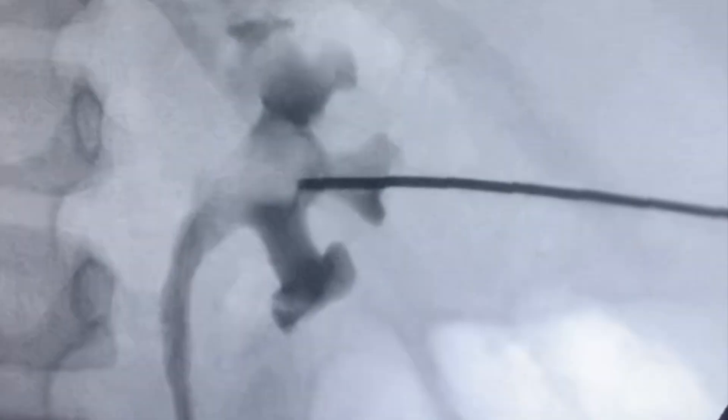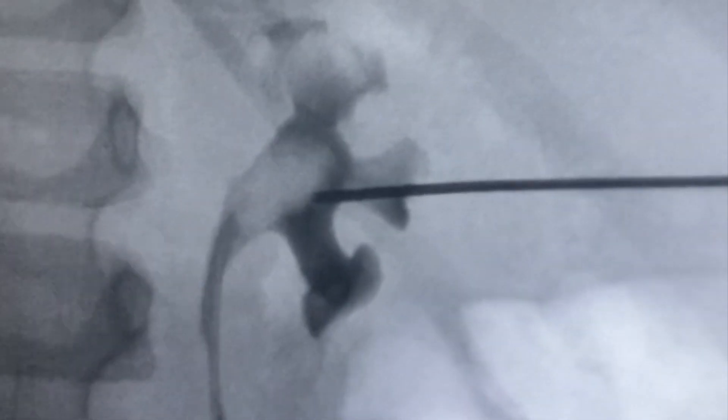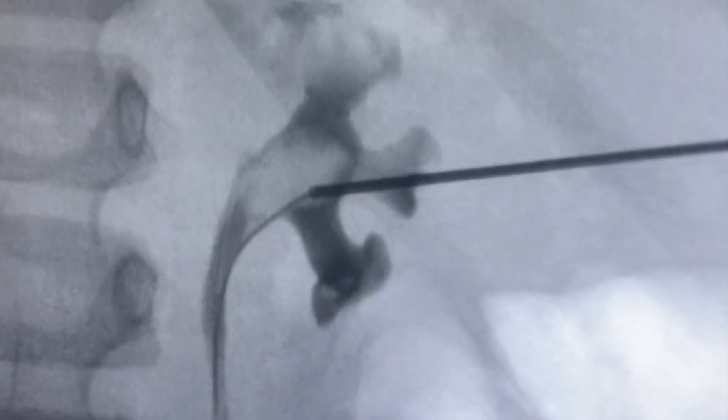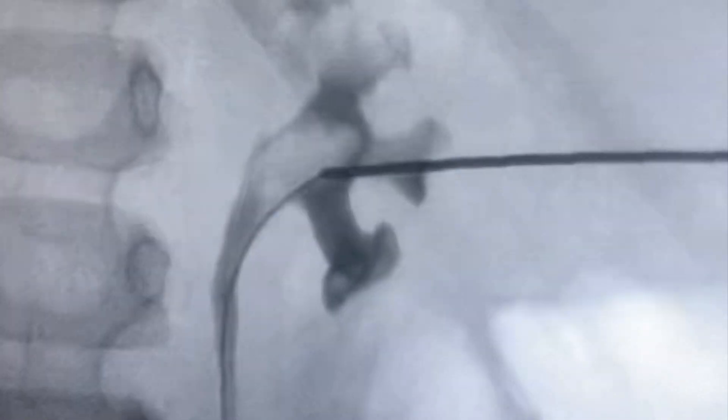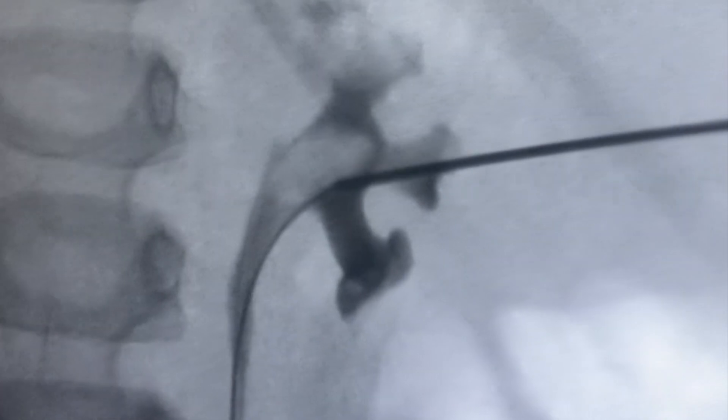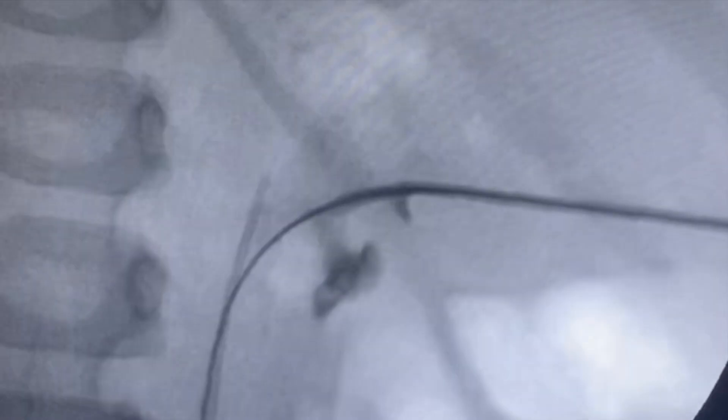The advantage of this calyx is that once you pass the guide wire, it generally goes into the ureter very easily because this calyx provides the straightest path to the pelvic ureteric junction.